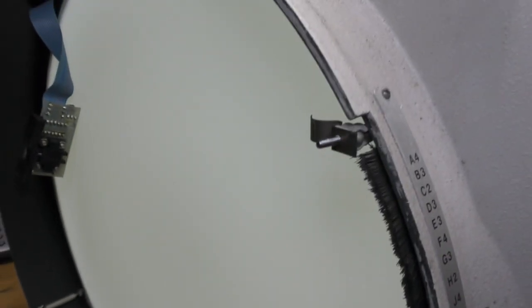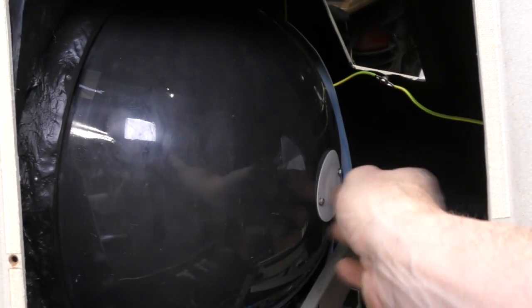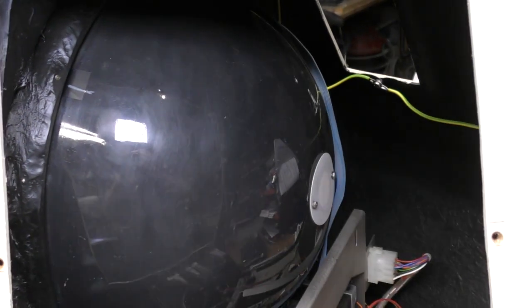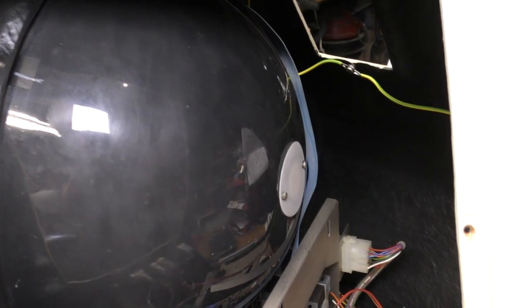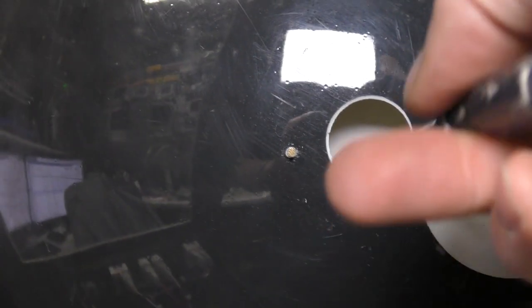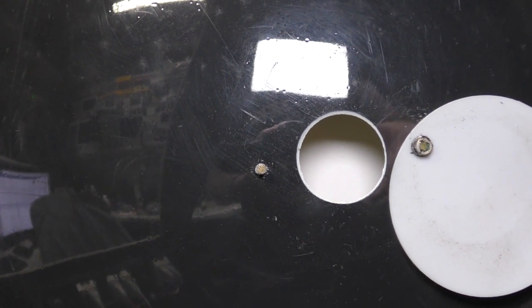And at the front, we've got this translucent white film. If I just shine a torch, it gives very even illumination. Obviously, it's important that all the dots are the same brightness. There's a plastic hemisphere with a white diffuser here, and the flash tube and filter assembly just goes behind here. In here, I think there's another diffuser. It actually feels like glass, just to give a more uniform light field.